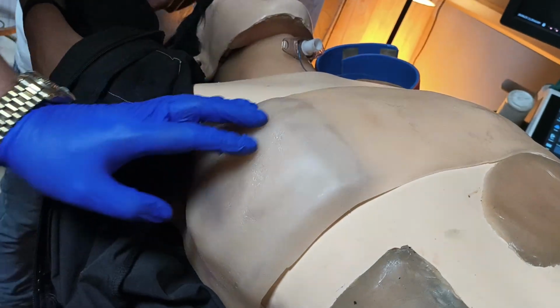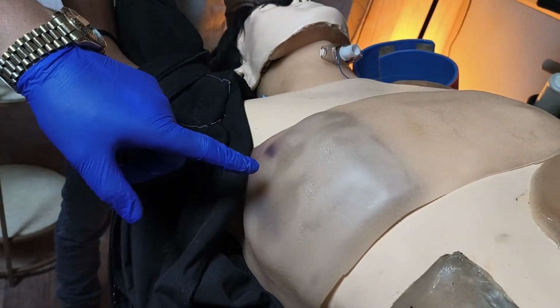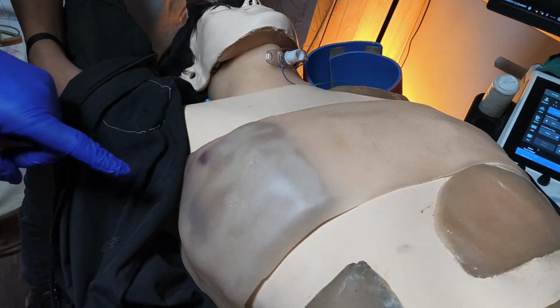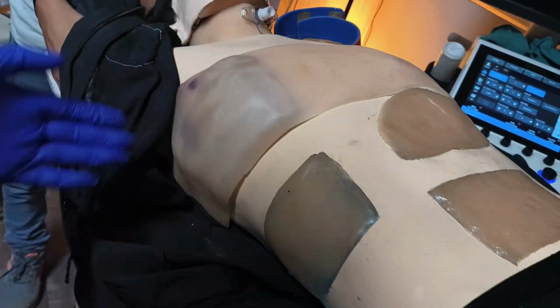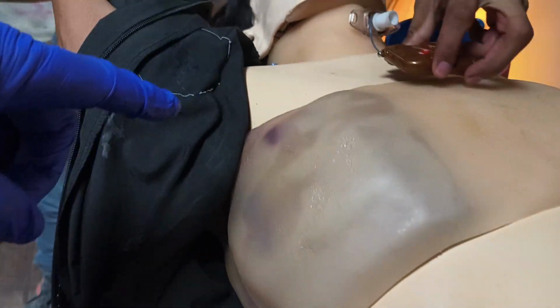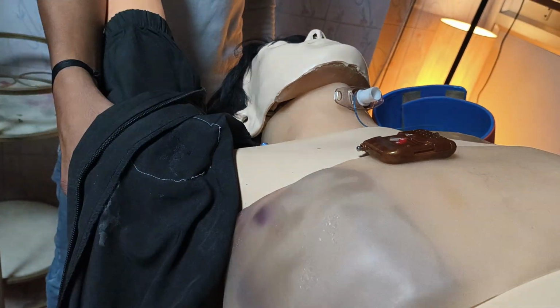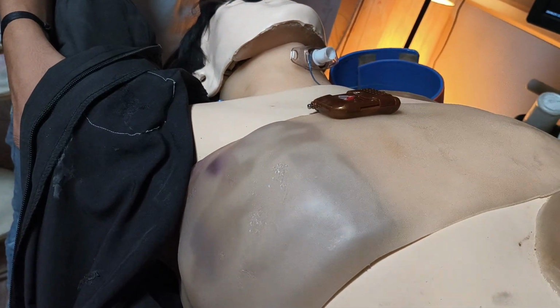But before that, now after the needle decompression, the chest is rising on the right side as well. Yes, you can see. So this is what really happens in clinical scenario also. Patient's chest starts rising and the patient has significant improvement.